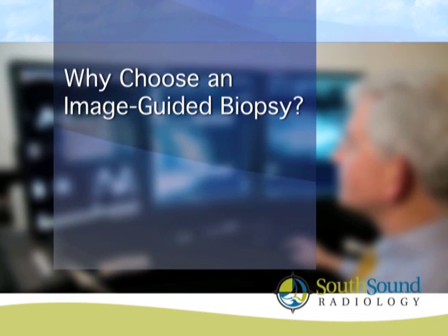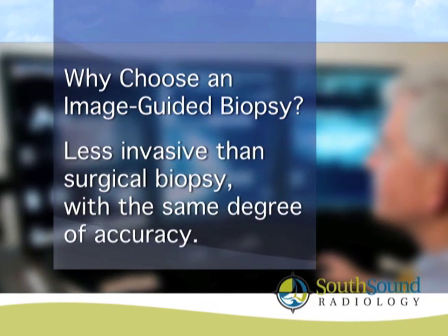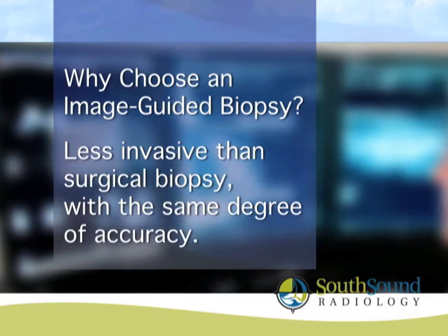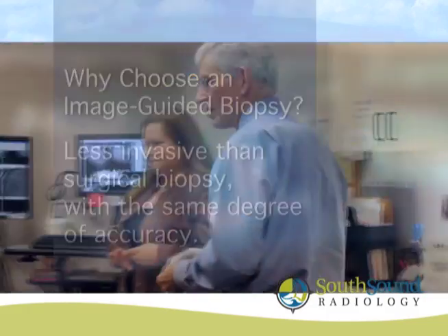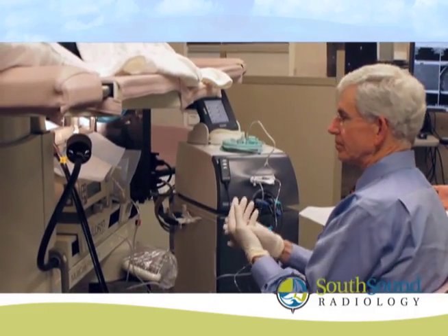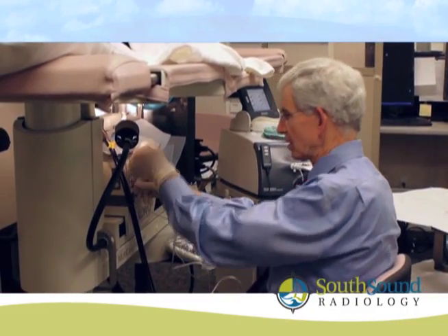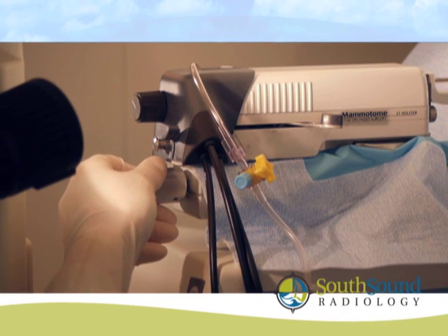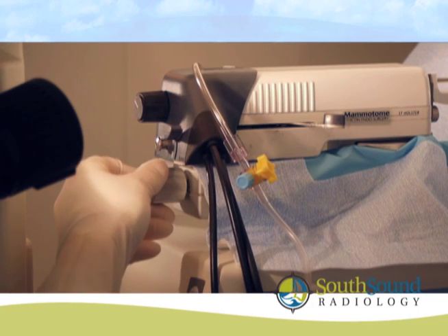Image-guided biopsies, whether ultrasound, stereotactic, or MRI, are less invasive than a surgical biopsy and provide the same degree of accuracy. Some of the abnormalities that are biopsied are benign, not cancerous. If this can be determined with a simple needle biopsy, a more invasive surgical biopsy can be avoided.